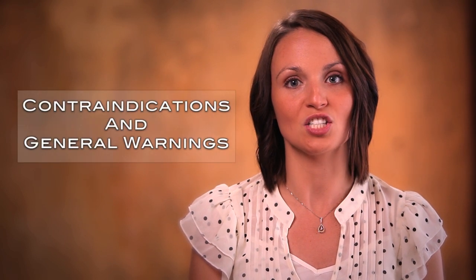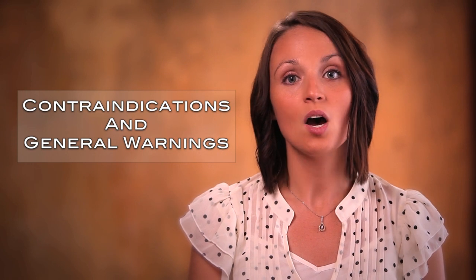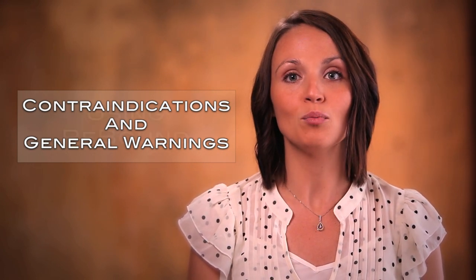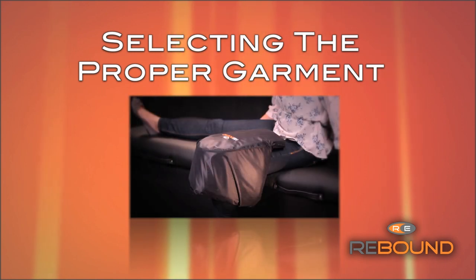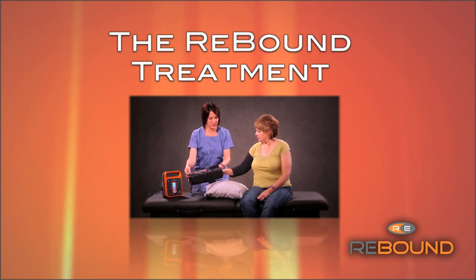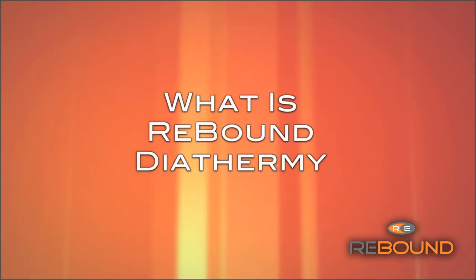First, we will cover the contraindications and general warnings. It's important to start with who should and shouldn't be using Rebound. Then we'll move into using Rebound, starting with how to use the Regenerator, then selecting the proper garment for your patient or athlete. What is tuning and how to tune the garment? Then we'll talk about what actually happens during the Rebound treatment. And finally, what is Rebound Diathermy? For those of you who would like more information on the science and whys behind Rebound, that final section is for you.